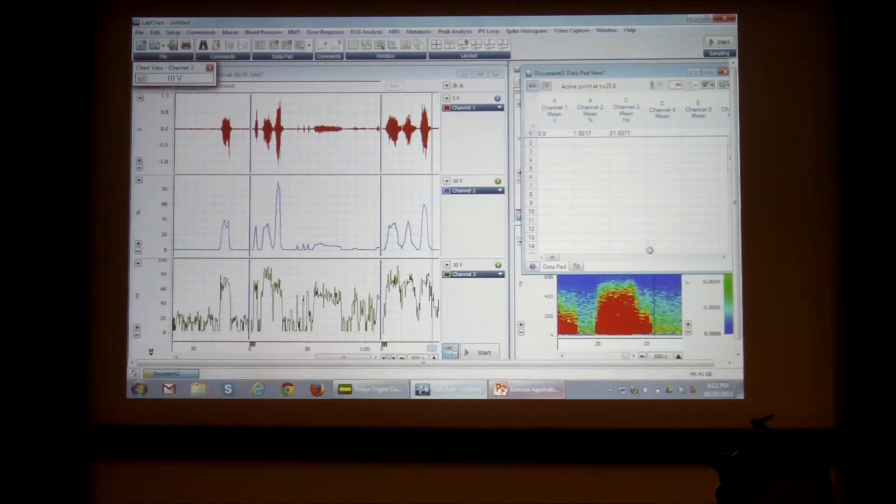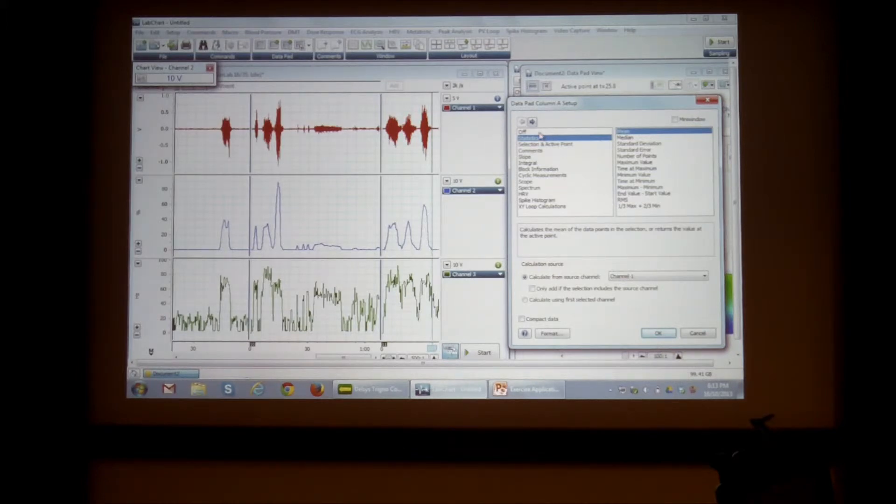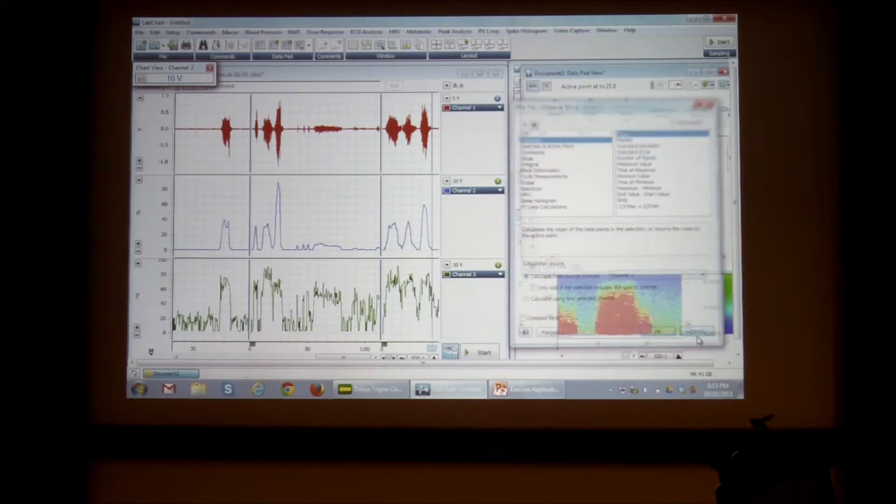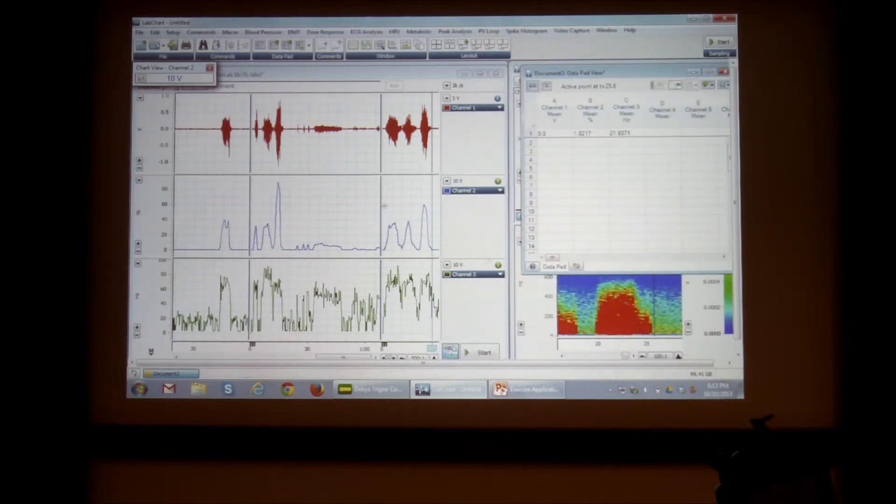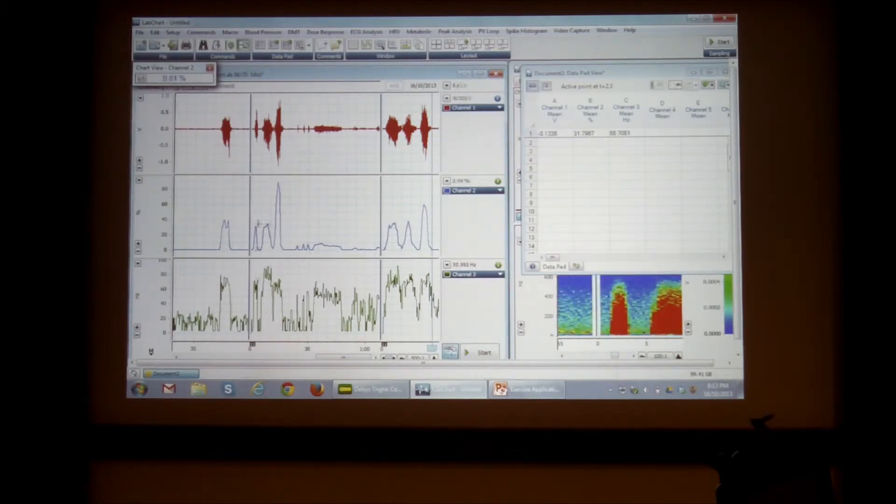So what we can do is we can set up our data pad columns to maybe show, what we can do is we can also add comments to our recording. I'll show you that first.